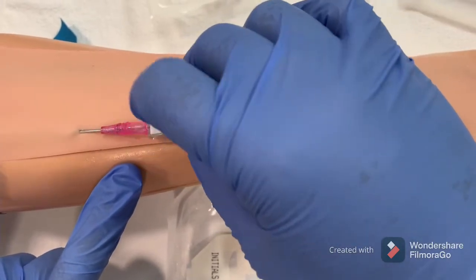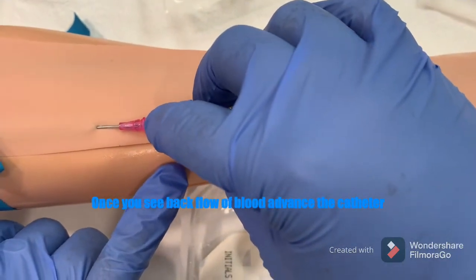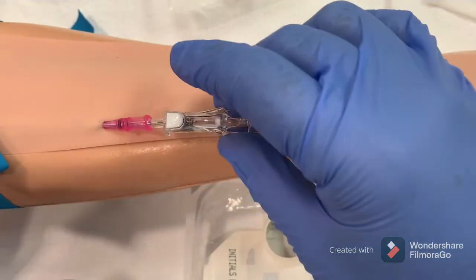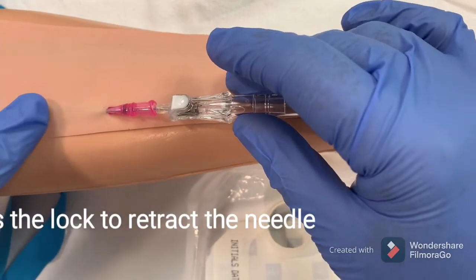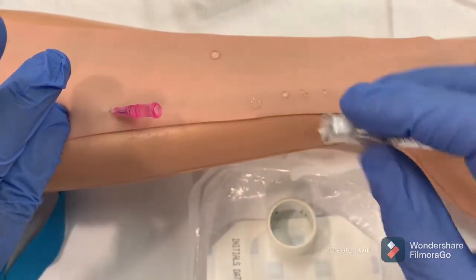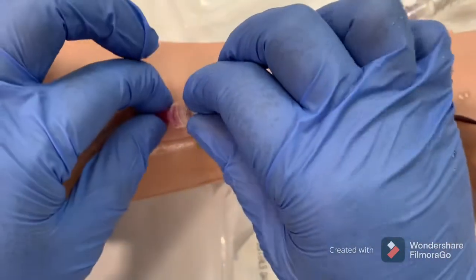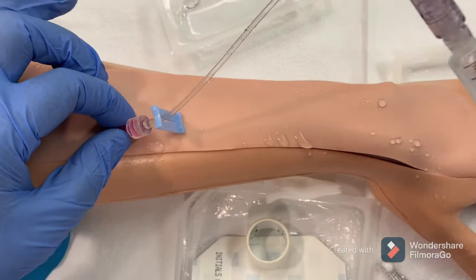Once you see the backflow, advance the needle completely, advance the sleeve of the catheter, and retract the needle by pressing the lock. Then untie the tourniquet and press the tip of the catheter to occlude the blood flow. Press the lock and remove the needle — it's retracted.